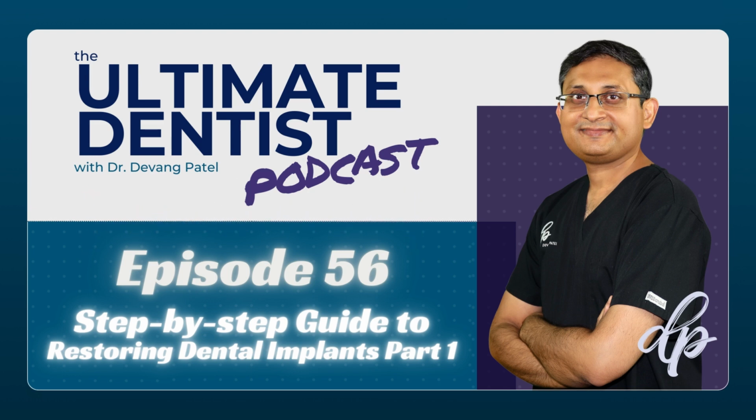You want 1.5 millimeter distance between the tooth and the implant. You want 3 millimeter distance between 2 implants. So make sure that you have enough space for 2 implants to be placed. And if you think you don't have enough space, then it could be 1 implant and a cantilever bridge.